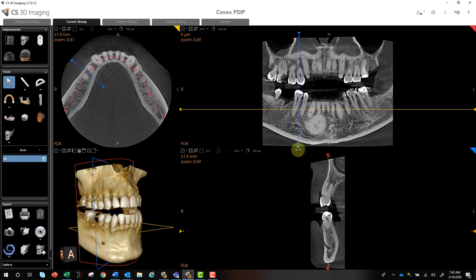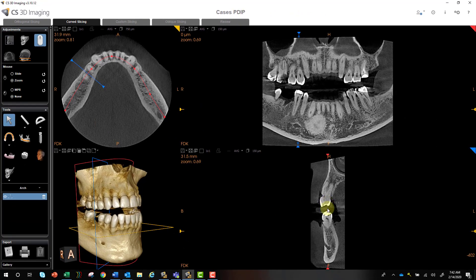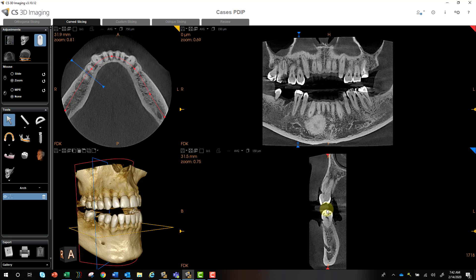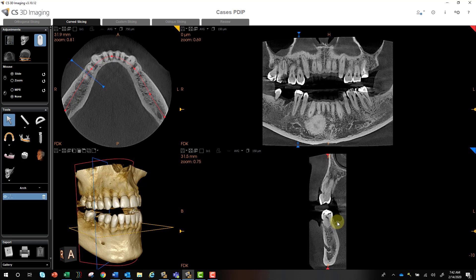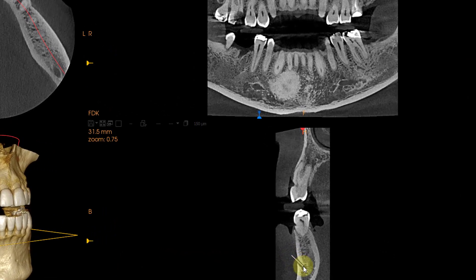I can move my cross-sectional view, and if I'm looking in the lower right, this is my blue view — everything is color-coded. Until I see my mental foramen, which I can see here, now I can make sure that my mouse wheel is on slide. If it's on zoom and I move my mouse wheel, it's going to zoom in and out. If I'm on slide and move my mouse wheel, it's going to slice through. So on slide, I'll select my nerve mapping tool and can begin in my cross-sectional view with a single click.